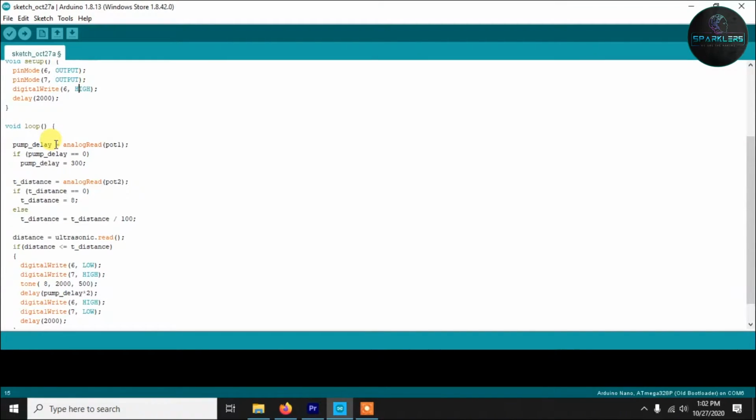Now here 0 means 0. So what we are doing is, if the potentiometer is not working, or if you have set the potentiometer to 0, in that case the pump delay will be automatically set to 300. Why? Because it is the default delay. And if there is some available value in port 1, in that case that will be the pump delay. Remember, in the pump delay we have a value between 0 to 1023.